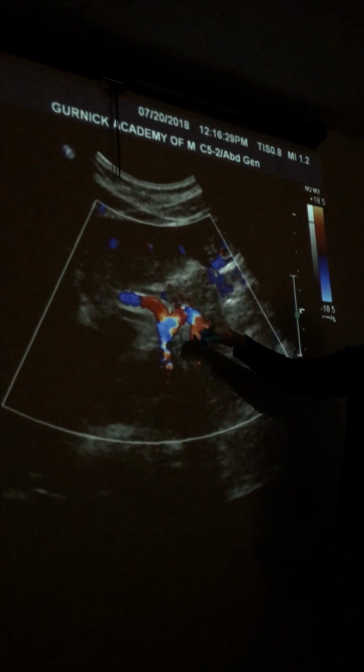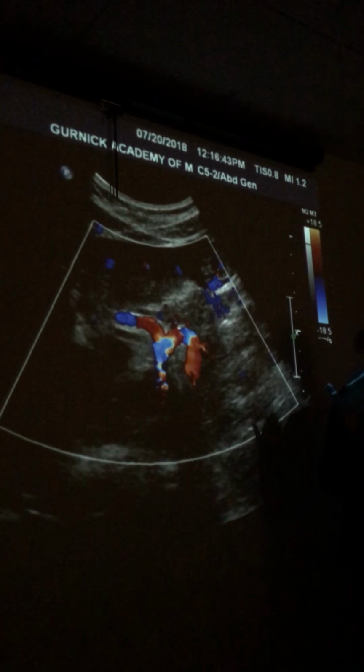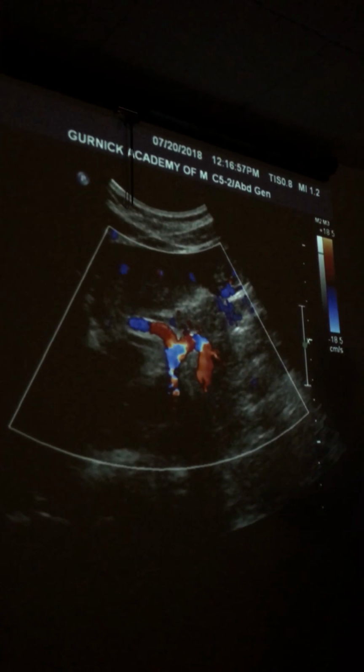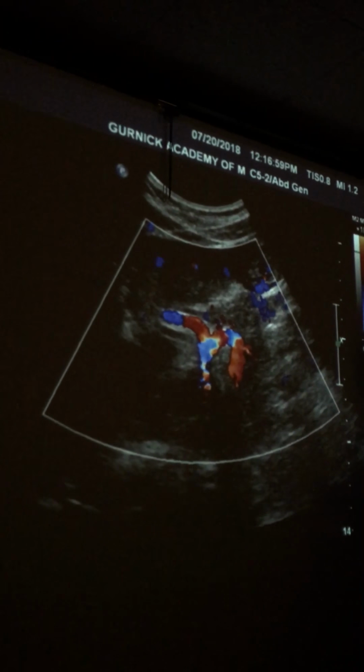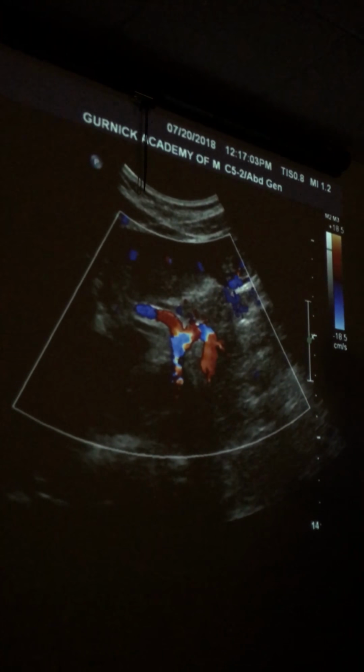But I gotta use things as a window, you guys. Remember, I even told you, I use the jugular vein. We all use the jugular vein as a window to see the carotid. When my guy has calcification, arterial disease in his legs, and I have to image those arteries, I'm using the vein as a window to see through. So every time in the body, you're gonna have this opportunity. You just gotta have the wherewithal to know it's an opportunity, right? And that's why we're here practicing.